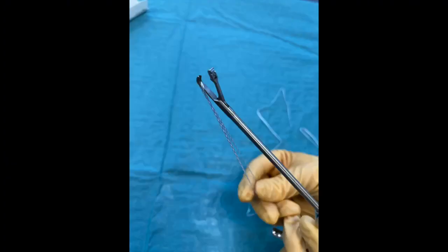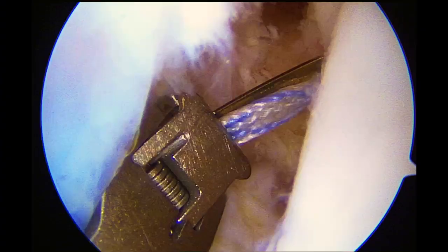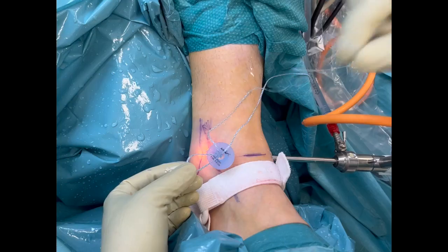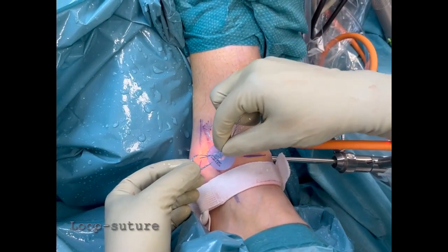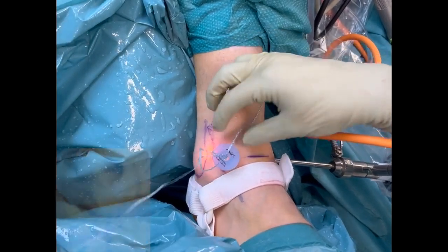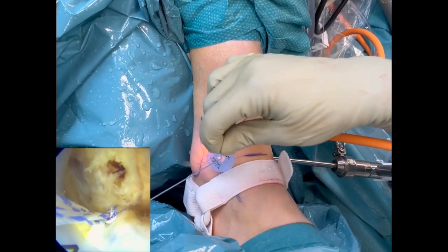The mini-scorpion is loaded with a 1.3 mm suture tape and passed through the ligament. The loop is pulled outside and one of the suture tape tails is introduced into the loop before the tails are tightened, and both tails are loaded into the eyelet of a 2.9 mm pushlock short anchor.